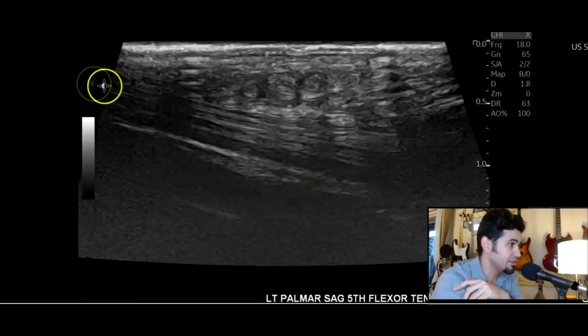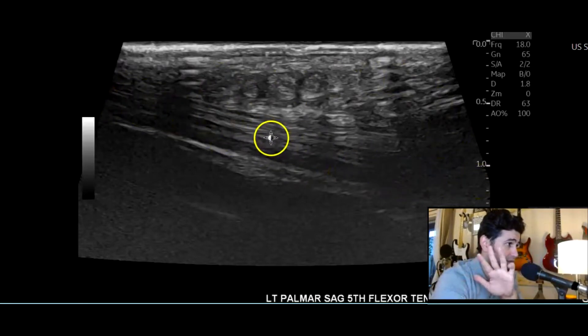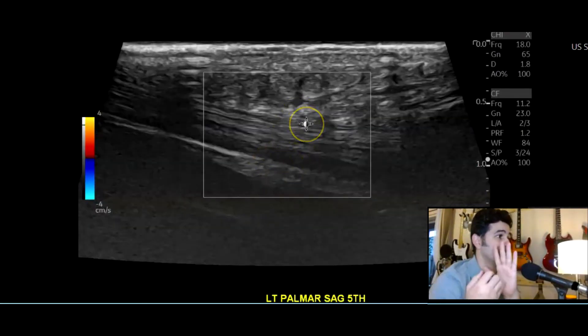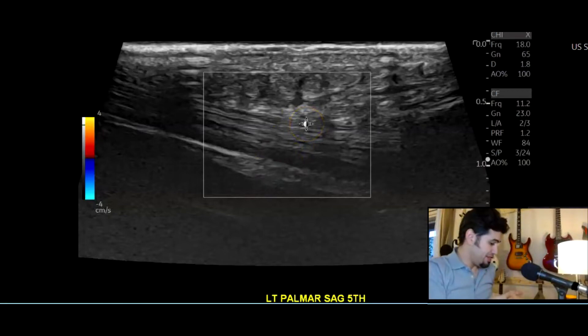Then I changed to the 24 megahertz probe, brought it down to 18 megahertz. Here you can see it very clearly — here's the flexor tendon of the fifth digit, the pinky, which is where the wound was closest to. It's good — there's no laceration there.